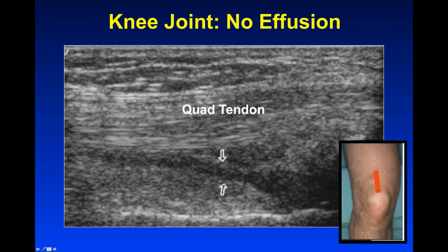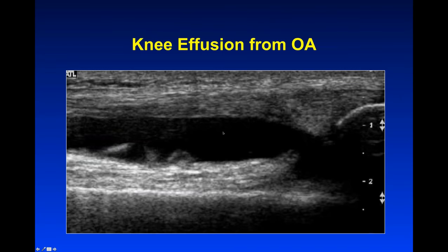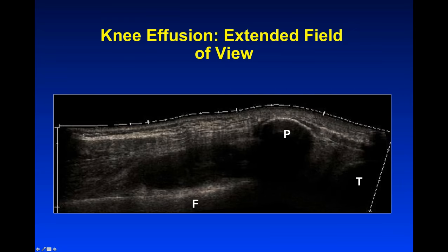For knee joints, we place the probe at the superior pole of the patella and translate it back and forth. At that view you'll see the quadriceps tendon, then two fat pads — the suprapatellar fat pad and the pre-femoral fat pad — separated by the suprapatellar recess of the joint. When there is fluid, that line becomes distended up by fluid and some debris, separating our fat pads above the patella. An extended field of view image shows the quad muscles down to their tendon, the patella, the infrapatellar tendon, femur, and tibia. Extended field of view technology is very useful for showing large pathologies, measuring them accurately, and communicating anatomy to the surgeon.